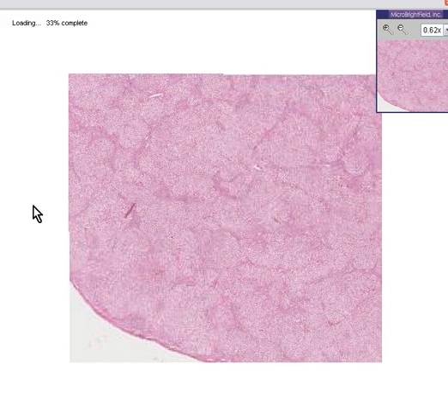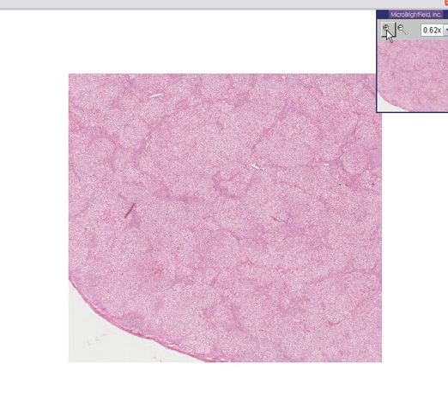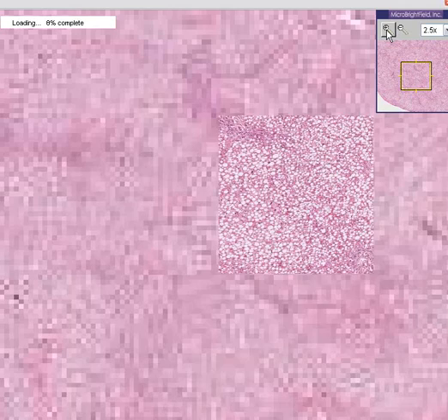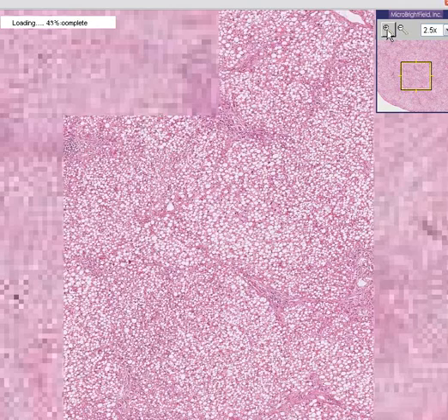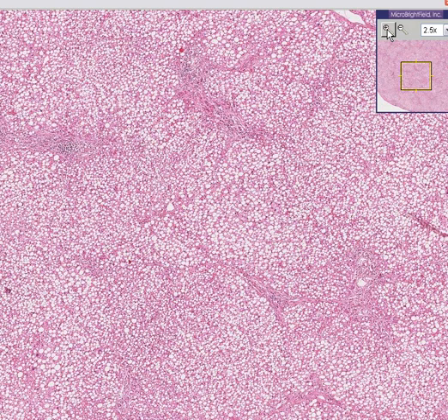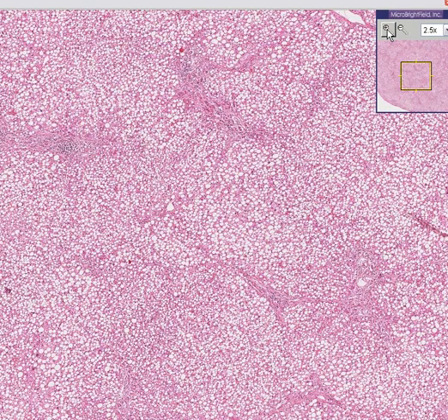Let's look at it microscopically. Wow. In the other two fatty livers, we guessed maybe from 10 to 20 to 50 to 60 percent of the liver cut section was fat. Here, I would probably guess that if you dissolved all the fat out of this liver chemically, it might wind up being 80 or 90 percent of the liver weight.